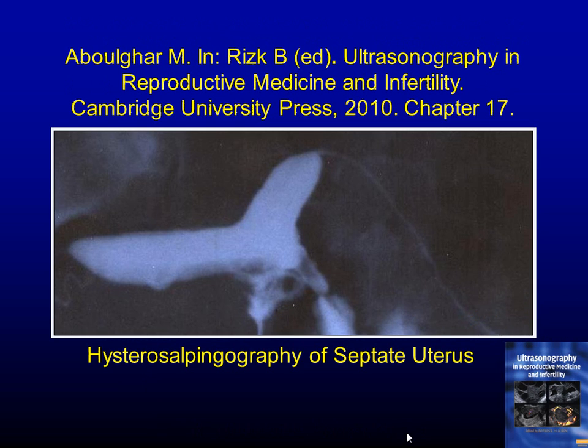But look at the X-ray, which is the basic clinical evaluation. X-rays are the first step. They are of very limited value. Like a century ago, X-ray was the only thing that was done. Today, really, ultrasound has almost completely replaced the X-rays. However, they have their values in different situations.